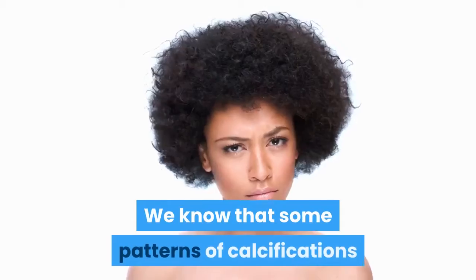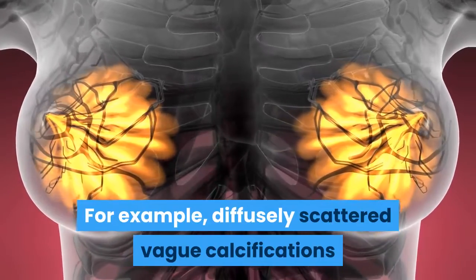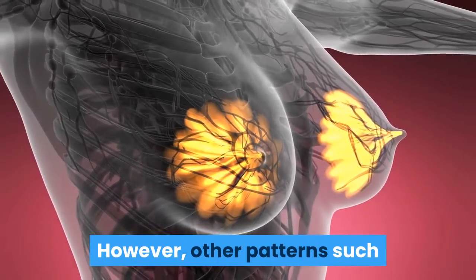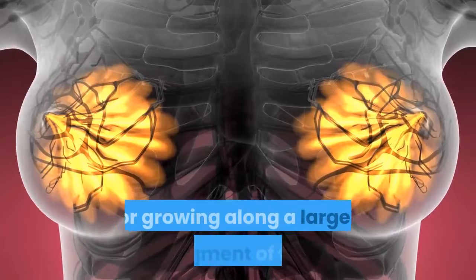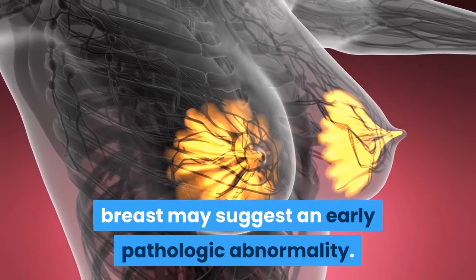We know that some patterns of calcifications are more suspicious than others. For example, diffusely scattered vague calcifications throughout the breasts are usually benign, non-cancerous. However, other patterns such as irregular microcalcifications forming a small tight cluster or growing along a larger segment of the breast may suggest an early pathologic abnormality.